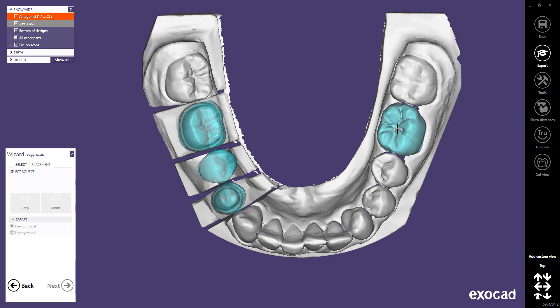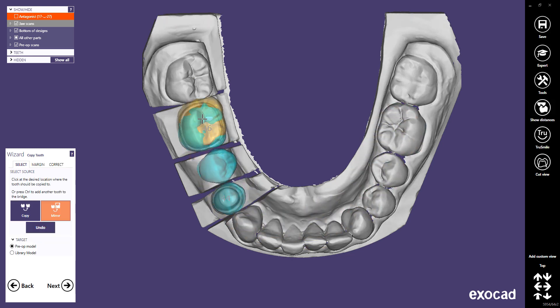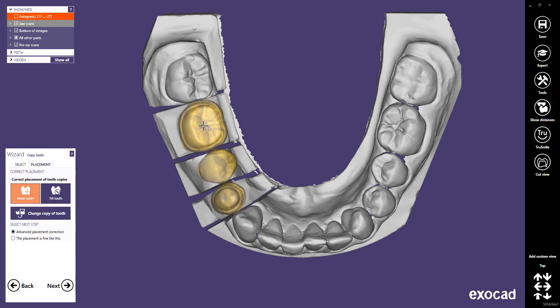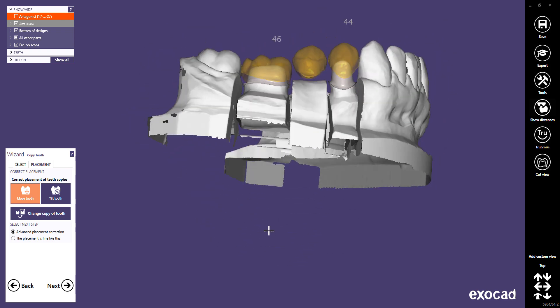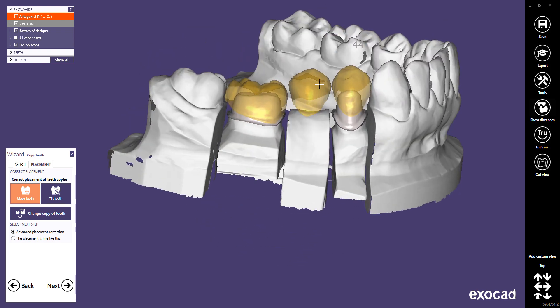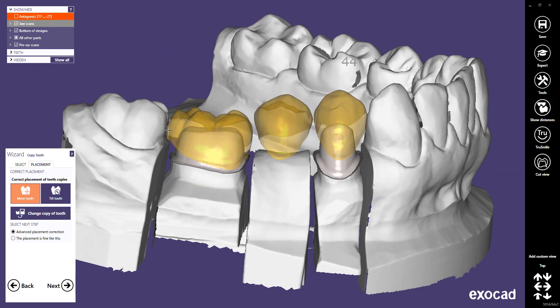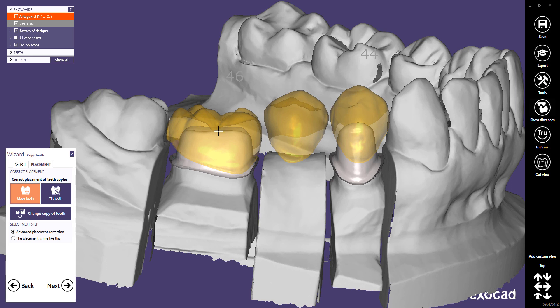Click the tooth to be mirrored and click the tooth to be replaced by this new tooth. Once you have finished the tooth selection, you can adjust the tooth placement already here in the Copy Tooth dialog. If the Move Tooth button is active, you can move the tooth exactly as in the familiar tooth placement dialog by using shortcuts.